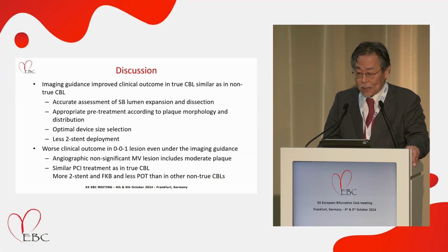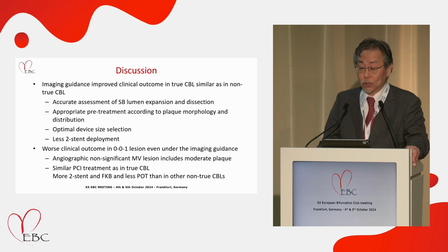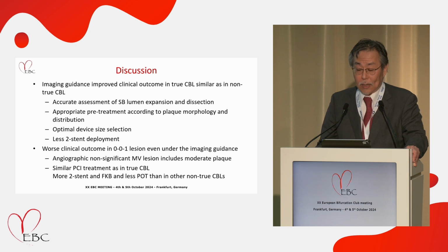Therefore, imaging guidance improved clinical outcome in the true coronary bifurcation region, similar to the non-true bifurcation region, because of accurate assessment of side branch lumen expansion and dissection, appropriate pretreatment according to plaque morphology and distribution, optimal device size selection, and less two-stent deployment.